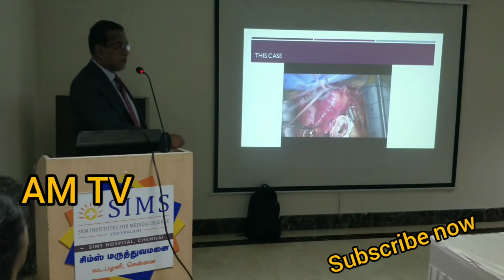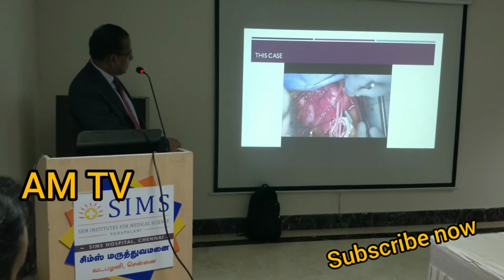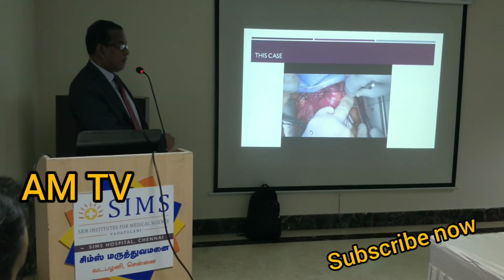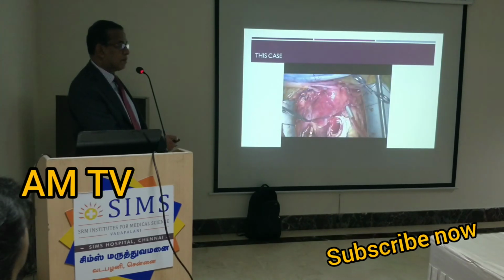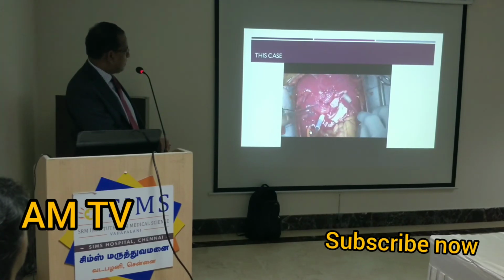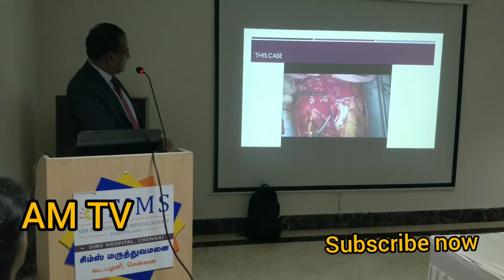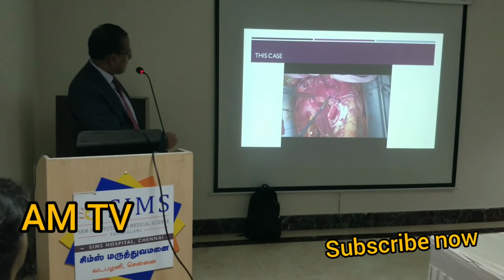We have to continue, because in the olden days we used to stop the blood flow to the brain by cooling the patient to about 15 degrees. Now we don't do that because sometimes it may be associated with more of a stroke and other problems. So now we don't stop the circulation. We give blood to the brain while we are doing the operation, and that is the arch of the aorta. You can see when we cut, you can see the branches all there.